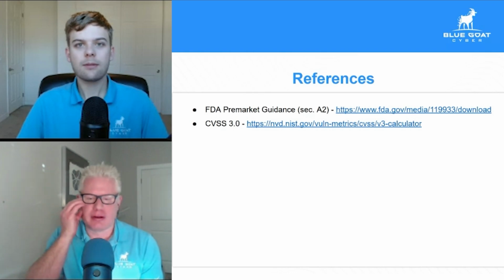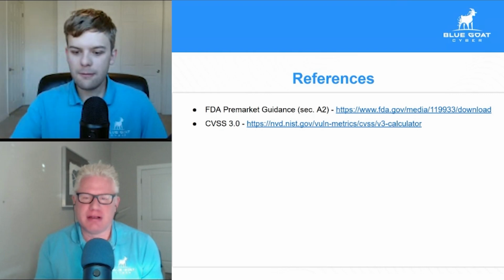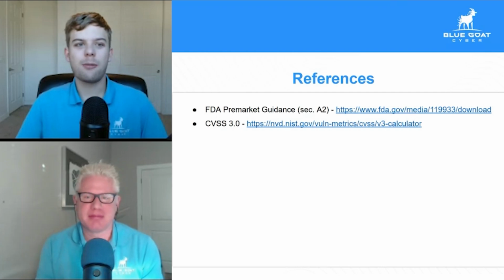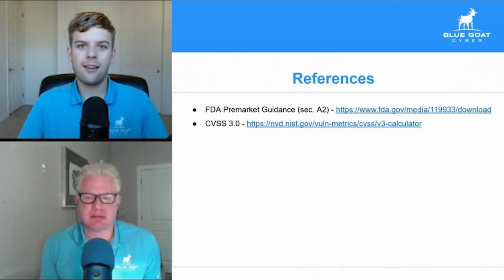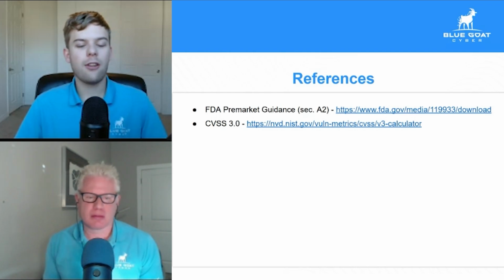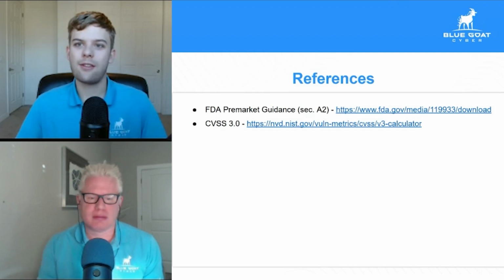Awesome. I don't see any other questions coming in here. So, any parting words of wisdom, Trevor, before we end our webinar here? Yeah, just making sure that manufacturers have their risk management process built in and it's something continuously referenced. I think a big problem that can come up with a lot of manufacturers is they'll create this ISO 14971 or TIR57 risk management process, and then vulnerability assessments are just ad hoc. So a risk assessment should always follow the same process. They should follow that risk management flow, and just making sure that everything gets the same treatment as far as a vulnerability perspective goes.